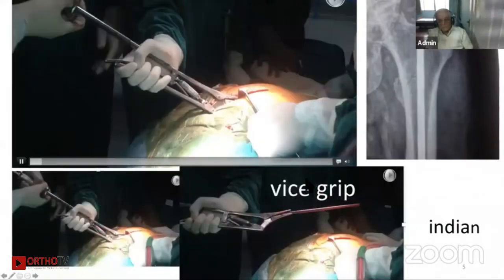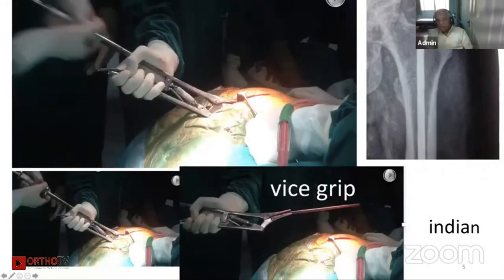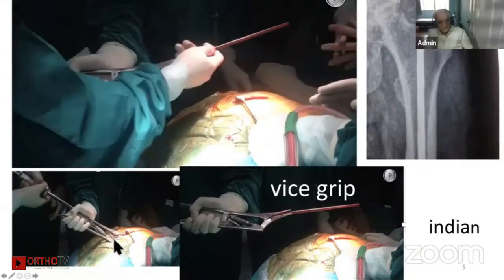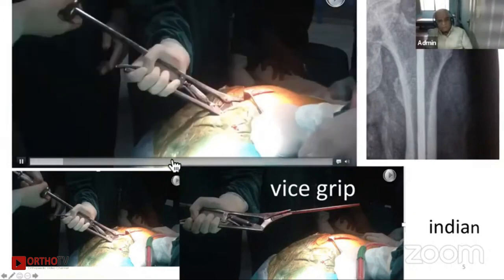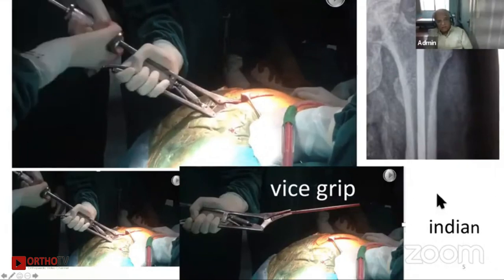And this is the vice grip. You can see here is the one. You can see how to hold it. This is the one which is holding it. It has come out so beautifully. It has a hammer which you can take onto it. And this is also, again, an Indian instrument, which is much easier to buy. And as you can see, once it is gripping here, it will not leave it. And you can really take it out.